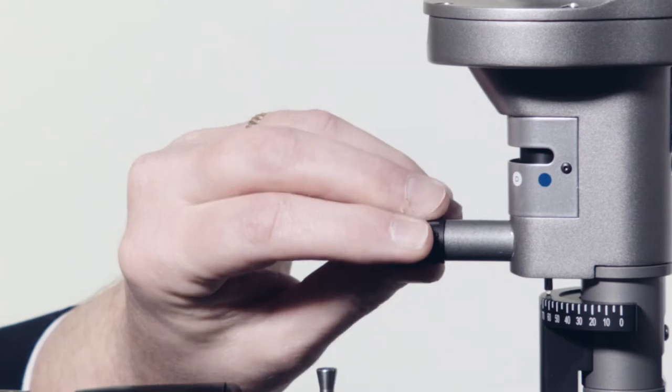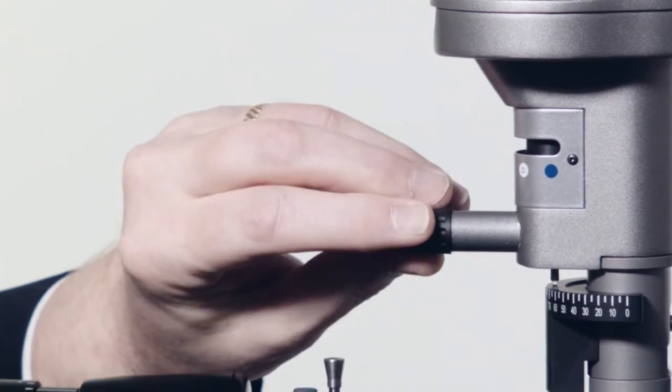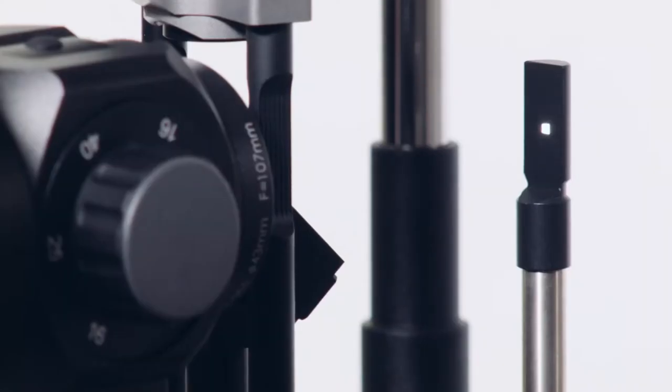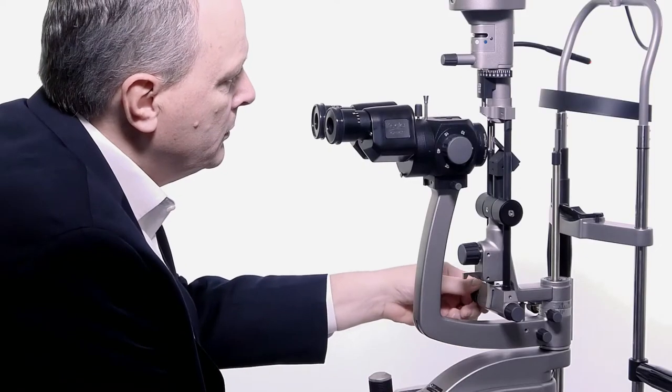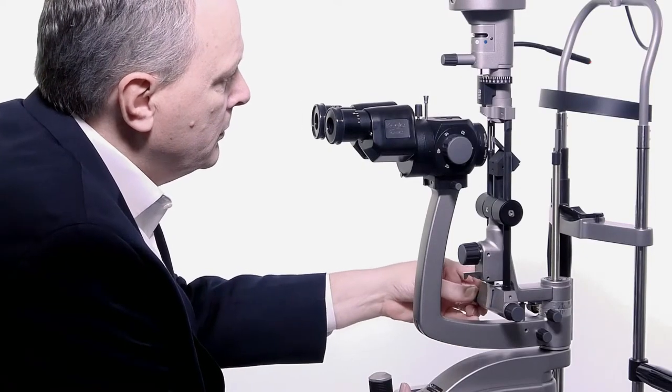Aperture can also be adjusted here. An exclusive 1mm square aperture can be used for uveitis assessment. Slit angle can be adjusted as required to perform the examination.